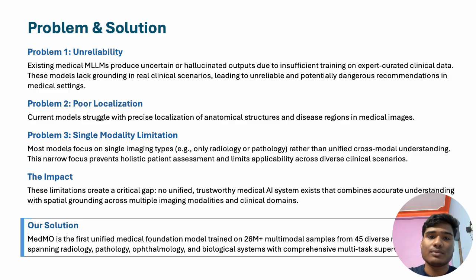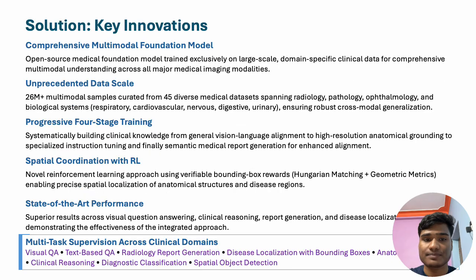To address this, we propose MedMO, a unified foundation model trained on 26 million multimodal samples over 45 medical datasets. MedMO has several key innovations. It is trained exclusively on large-scale medical data covering radiology, pathology, biological systems, and all the others.